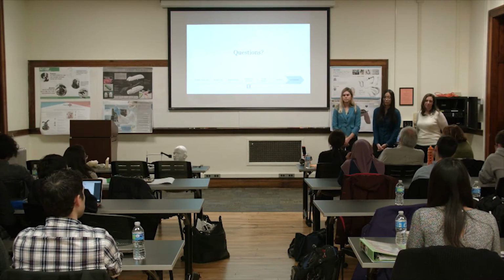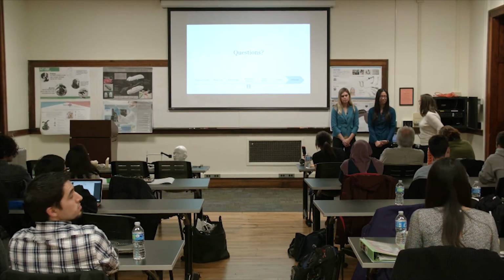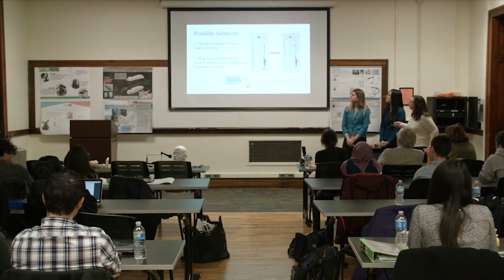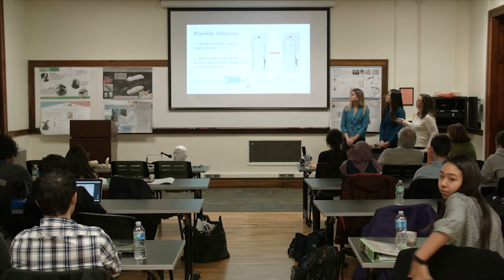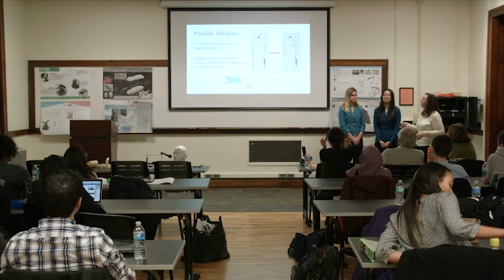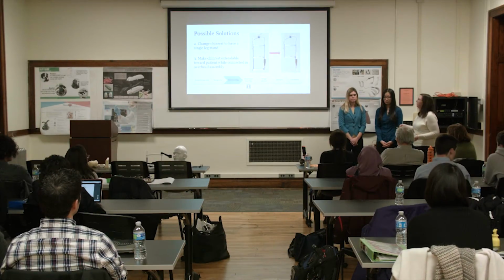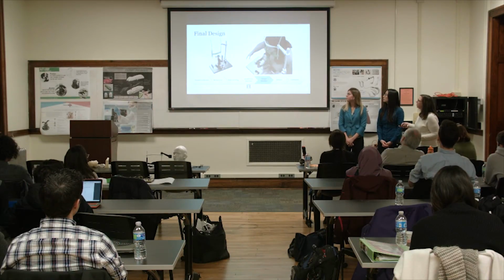So for the chin rest, how did you improve upon what already exists? Yeah, we didn't put that in here. The basic chin rest that comes with most slit lamps is most often plastic or some piece of metal with a plastic insert, and it's some radius, I'm not sure where they came up with this number, but they're not very comfortable, and I wouldn't consider them ergonomic. I mean, they serve a function, and that's all they do.